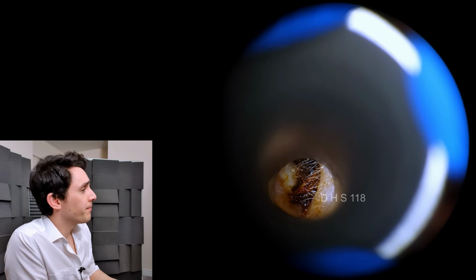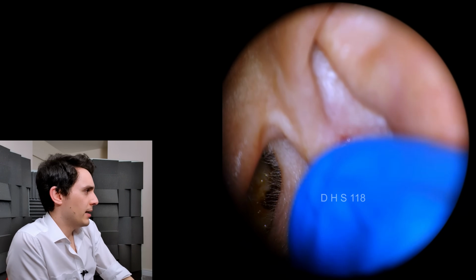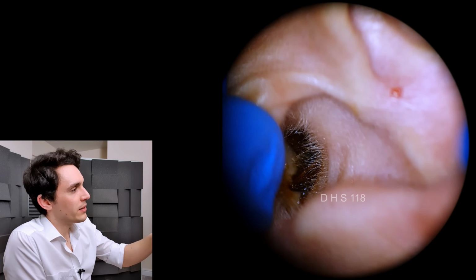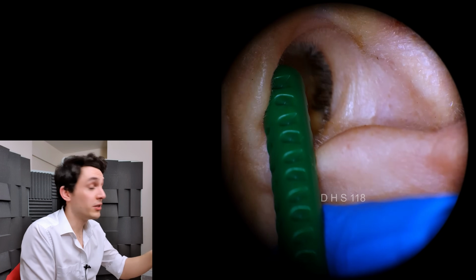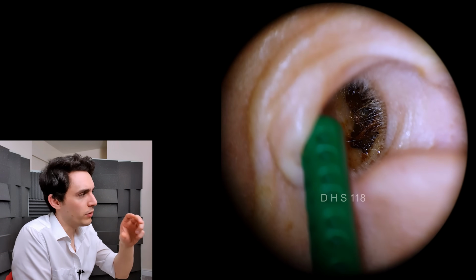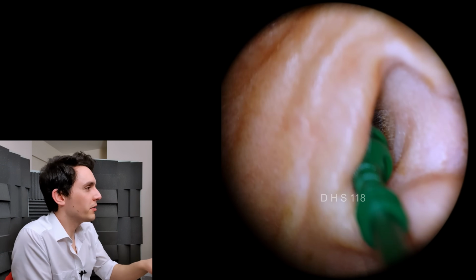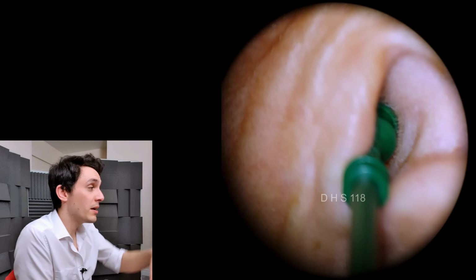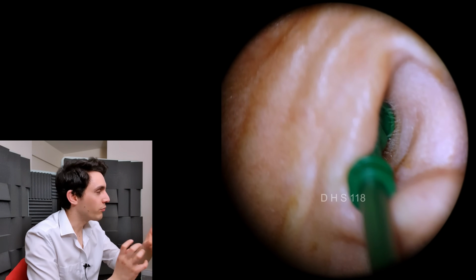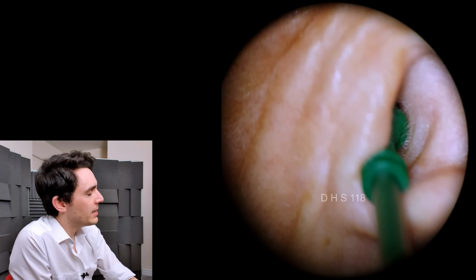Just checking with the speculum, and again we've got the second part of the boulder, so to speak, and just checking it with a metal speculum there, which I prefer. What we're going to do this time is I'm going to go in with a large, which is a different colour. The large is green and the medium is purple. They also make a small one, which is blue. I'm doing this in reverse order. Looking back, I probably should have started with the large initially, and then maybe dropped down to the medium. But even when it's used slightly inappropriately, it still works quite well. So again, just going in with the large to retrieve the final piece.